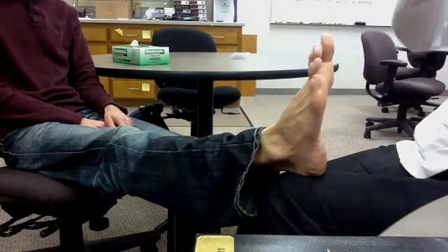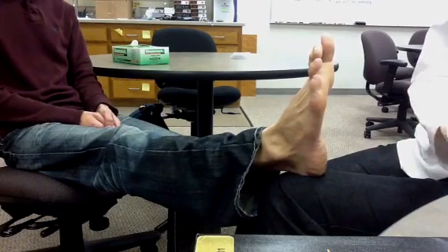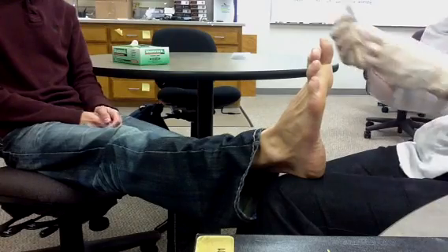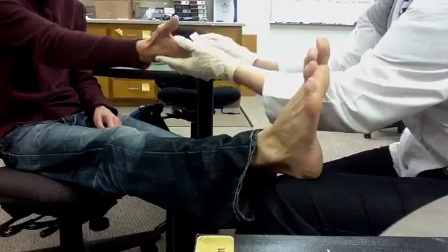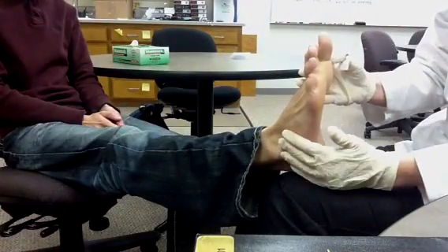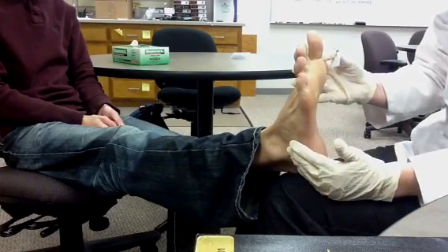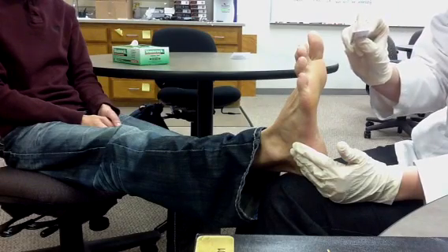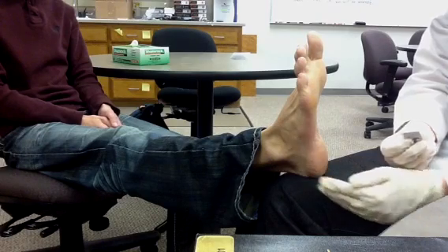Next, you will perform monofilament testing. Explain the monofilament procedure to the patient — it is key to demonstrate it first on their hand. This is the monofilament tool that we'll be using during your exam. As you can see, it doesn't hurt, so don't be afraid. Now that your foot is up on my knee, I'd just like for you to close your eyes and let me know whenever you feel it touching the bottom of your foot. It is important for them to inform you, because if you ask when they feel it, this may result in a false response.